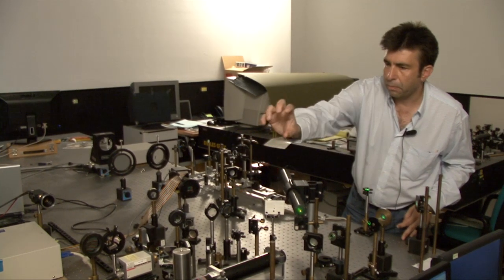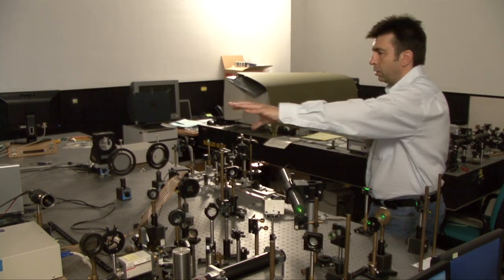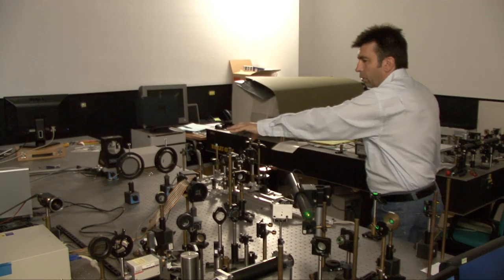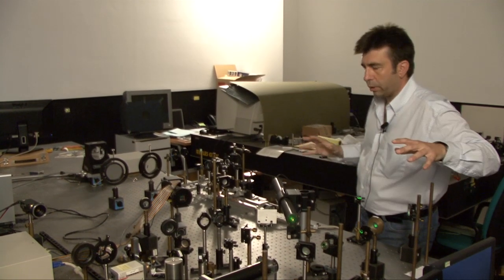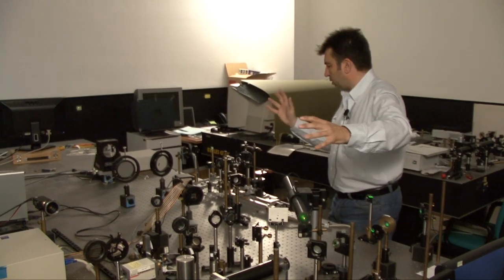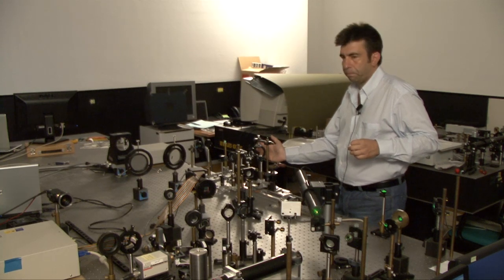This is a sensor measuring in real time the optics of the eye. The sensor is connected with the correctors, the mirror and the liquid crystal, through this computer here. All these working together produce the desired optics in a non-invasive way in the subject's eye.